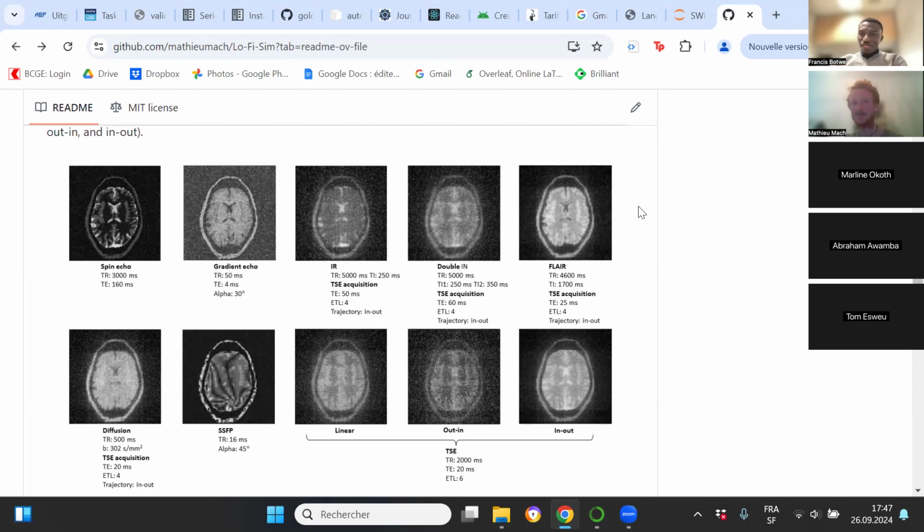Yeah, that would be great. Or whatever you think would be the best thing to have first, the ASL or to have the simulator on a web page? So then no matter if you use it from a Windows or from a Mac, everybody could access it. And the good thing is it's open access and you don't need to struggle to get it. And once the update comes, you go there and you can see it.